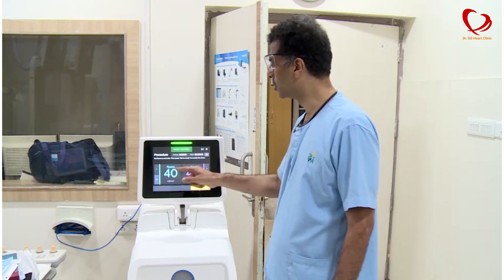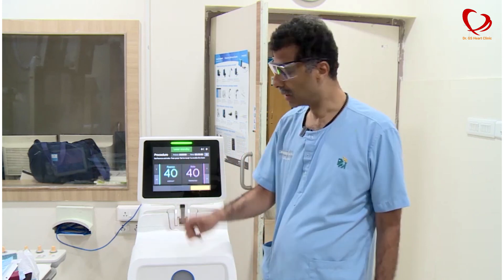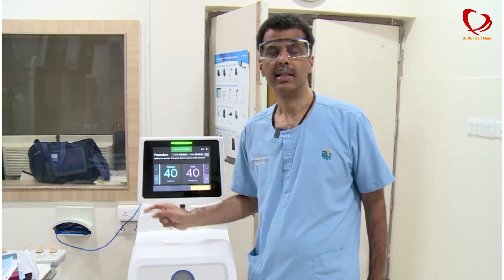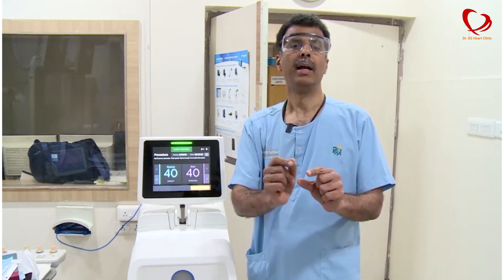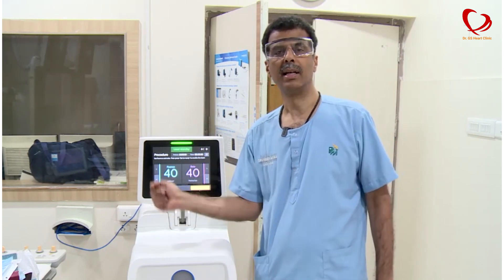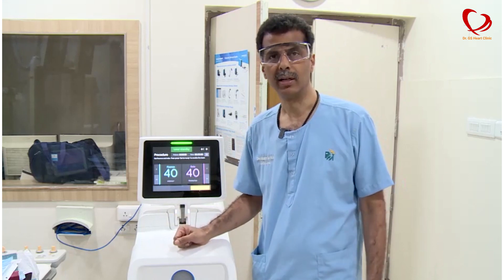We choose the settings and also the catheter size and deliver the laser energy, and the block is cleared. After that we put a balloon open and put a stent.